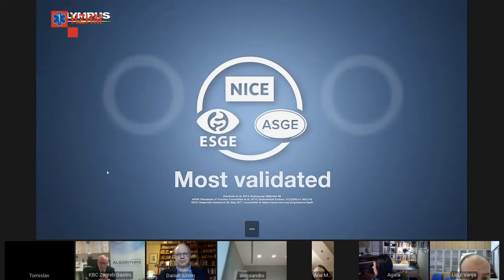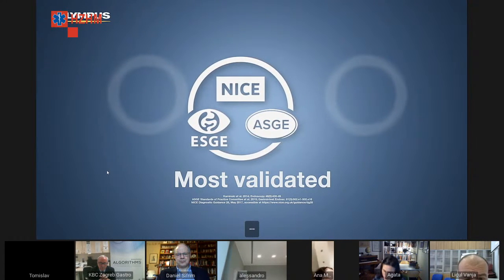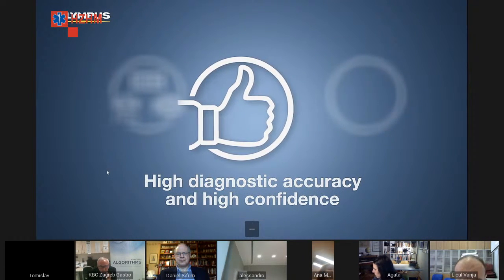NBI is the most validated and society-endorsed imaging modality for optical assessment of lesions. It supports high diagnostic accuracy and high confidence in diagnostic decisions.